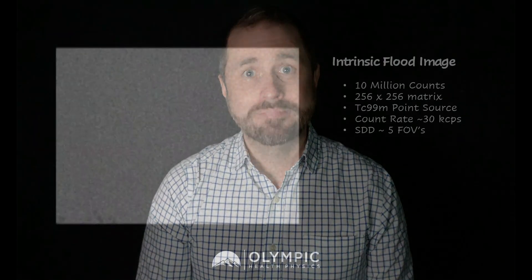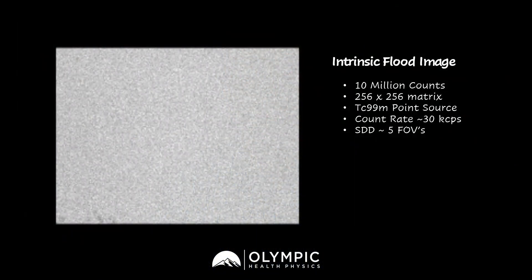Your job is going to be to try to figure out what the artifact is on the image. We'll give you a few seconds here to take a look at the image and see if you can figure out what's going on. Here we have an intrinsic flood image. This is done on a dual-headed camera, but we're only going to be looking at detector two. I want you to look at the image and see if you can find an artifact.